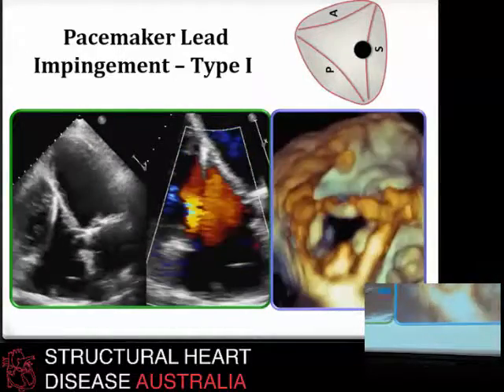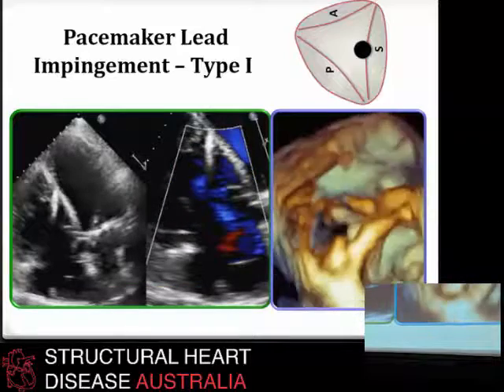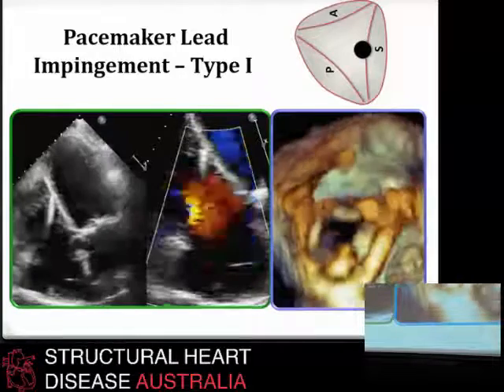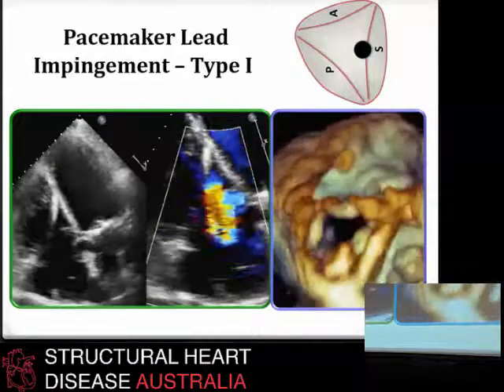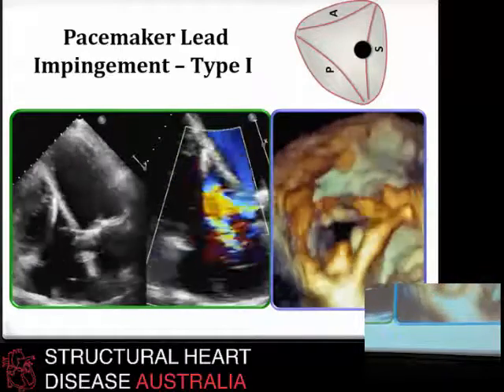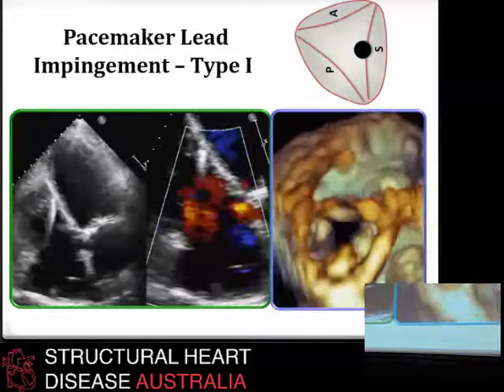With frequent right heart instrumentation, there is opportunity for tricuspid valve dysfunction at the time of pacing lead insertion with trauma to the leaflet, impingement or adherence of the lead to the leaflets, or during right ventricular biopsy.